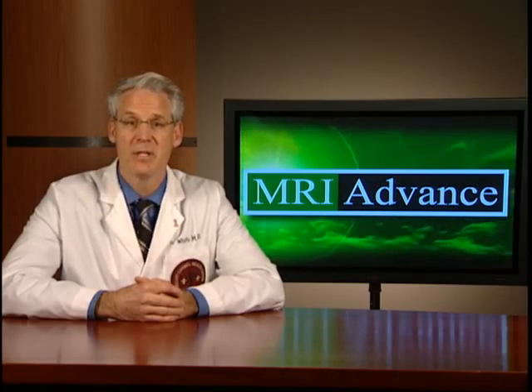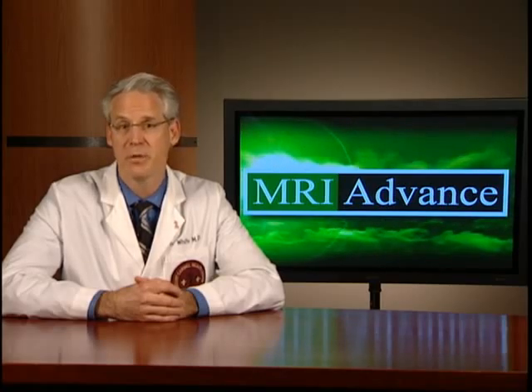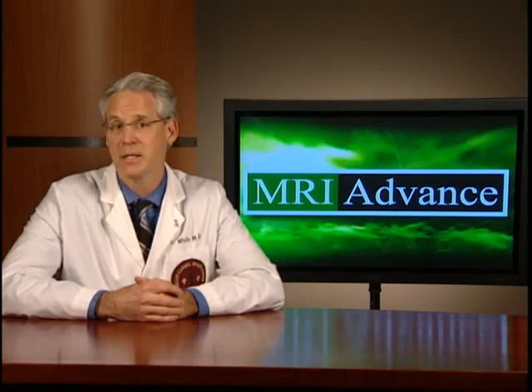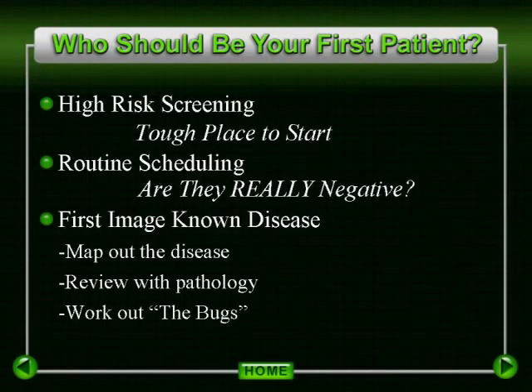Utilizing this approach to imaging our first patients was particularly beneficial, as it first of all helped us to run through our imaging procedure on a number of patients in a scenario where results were unlikely to have a significant impact on patient care. We had an opportunity to evaluate each component of our system and identify any difficulties that may exist, such as with our CAD system in determining CAD sensitivities, modifying hanging protocols, or working out difficulties with protocol recognition. It also allowed us to gain confidence in our protocols as we were able to identify known cancers and even in some cases unsuspected cancers.